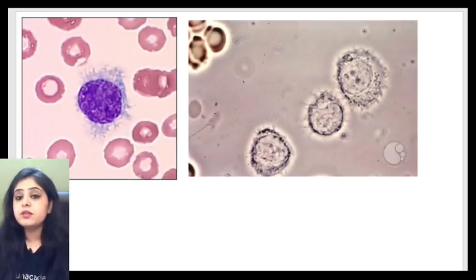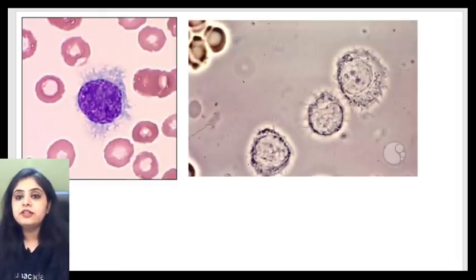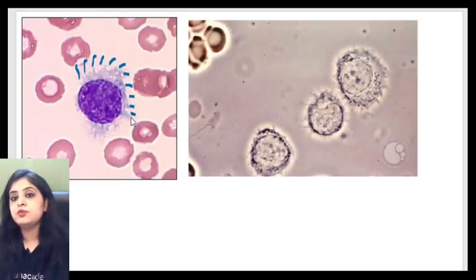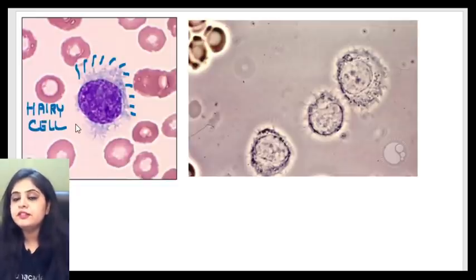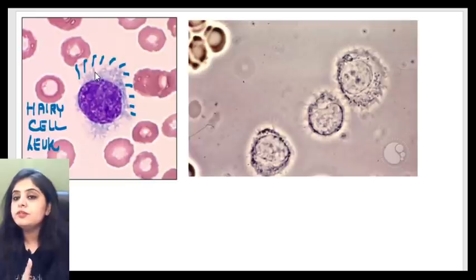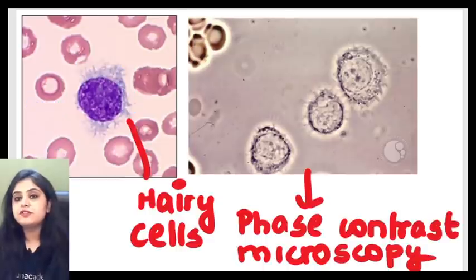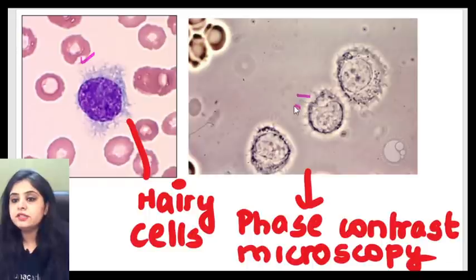Just by looking at this particular slide, you should be able to guess what these cells are. These are some kind of lymphoid cells showing cytoplasmic hairy projections — these are hairy cells, and the disorder is hairy cell leukemia. To best visualize these hairy projections, the best microscopy is phase contrast microscopy. Here in image one, you can clearly see those thin projections very well appreciated on phase contrast microscopy.